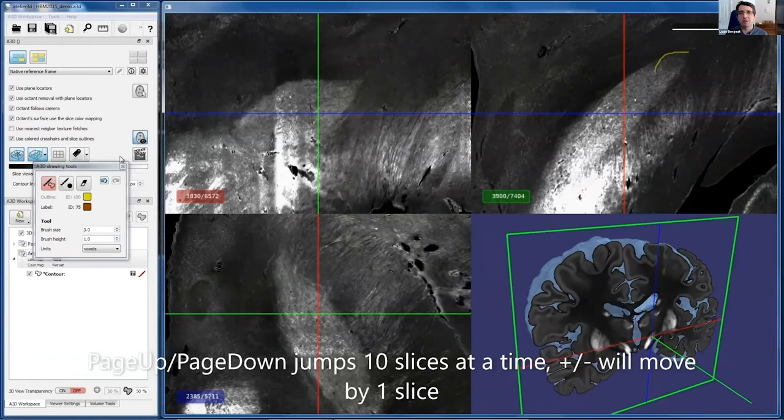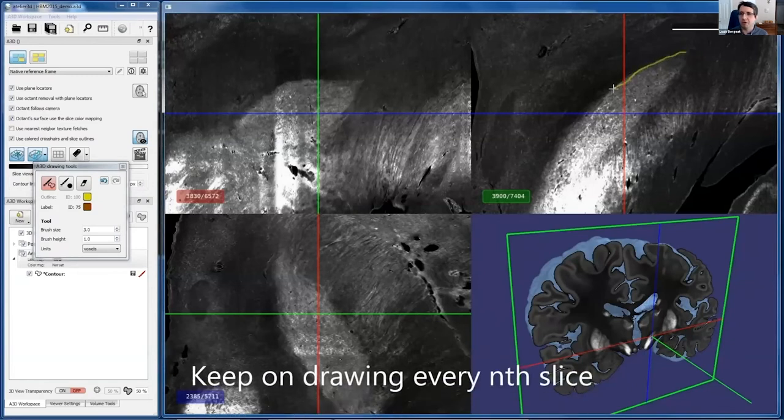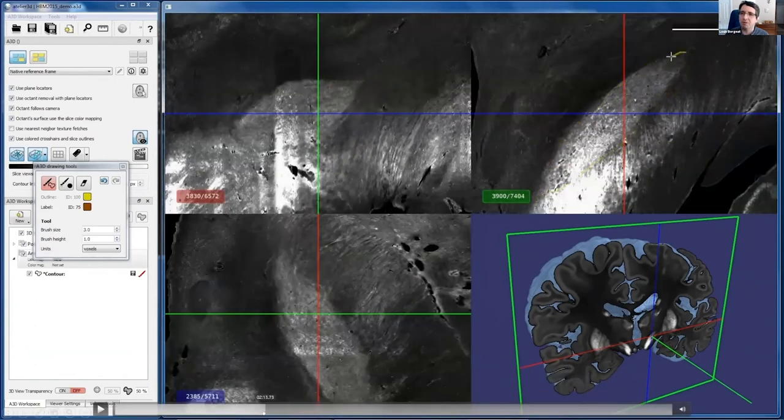In the process normally, and we'll discuss this when we talk about typical use cases, because the BigBrain is very large, most users will do their delineation of structures every 10, 20, or 40 slices, and then the reconstruction will interpolate. You'll obtain a mesh that you'll want to improve by making fixes in the in-between layers, as we'll see. What was happening was a demonstration of the undo feature and the eraser, basically. So we can move back a little.